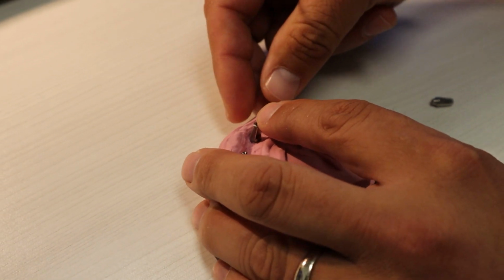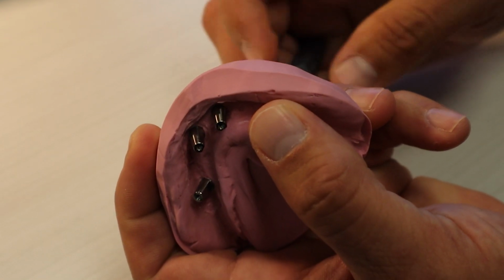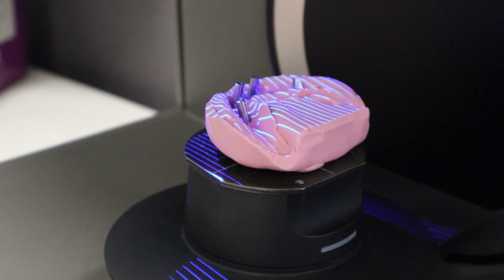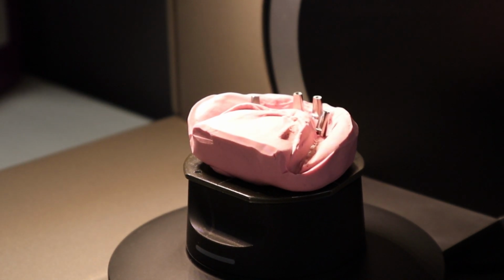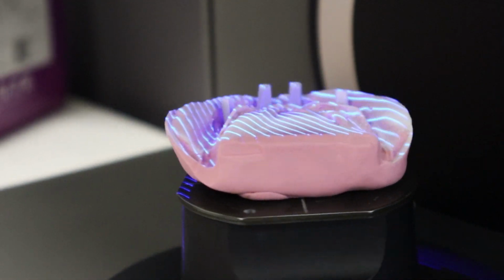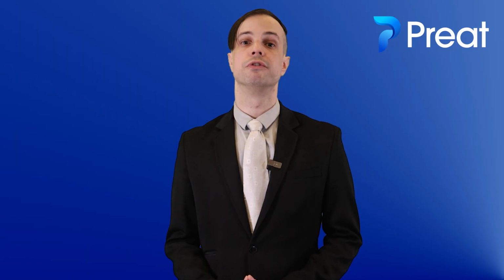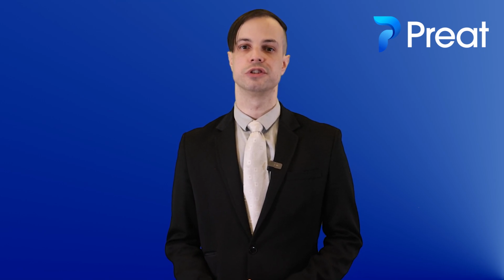All you have to do is attach the corresponding digital analogs to each of the implant copings in an impression, set up your order form in 3Shape or Exocad, and start the scanning process using any desktop scanner. If you haven't installed the latest Preat Choice Library, please visit our website to download the library or contact our service team. It's important to mention that as of the creation of this video, 3Shape does not allow for scanning of impressions for implant cases, so it will be necessary to utilize a third-party software such as MeshLab to assist with some of the steps necessary.